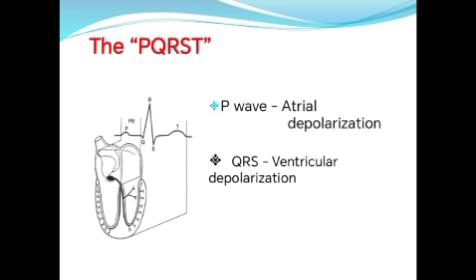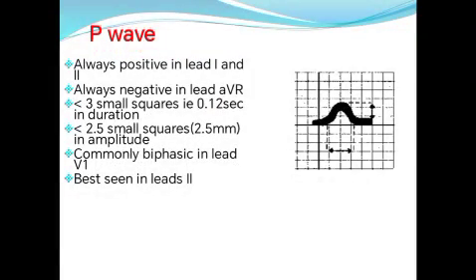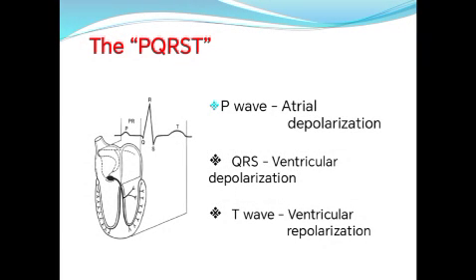This stands for ventricular depolarization. T wave is for ventricular repolarization. Okay, we will talk about each one separately and in detail to make this very clear.